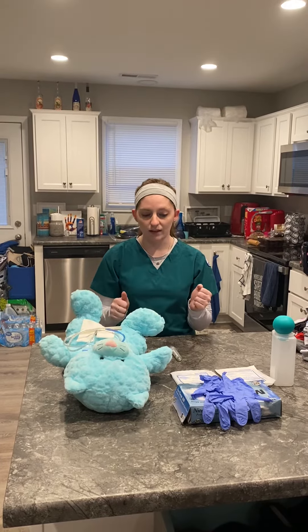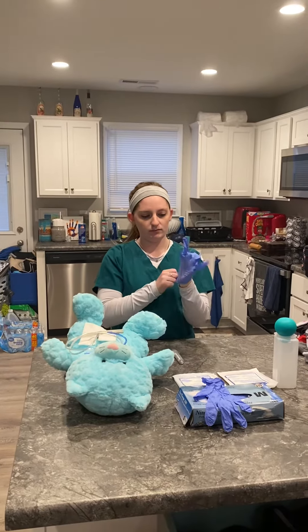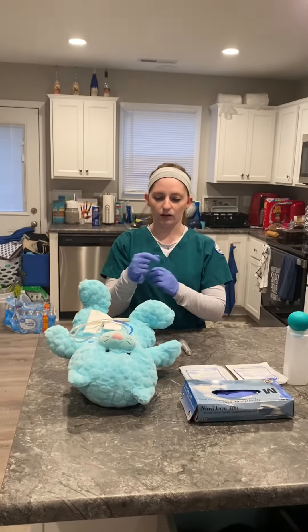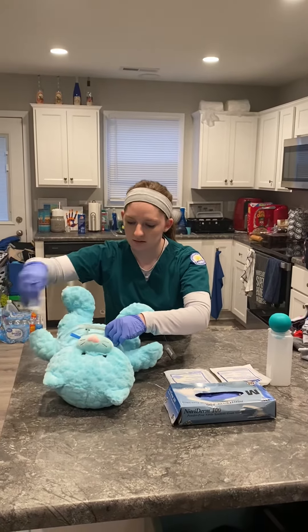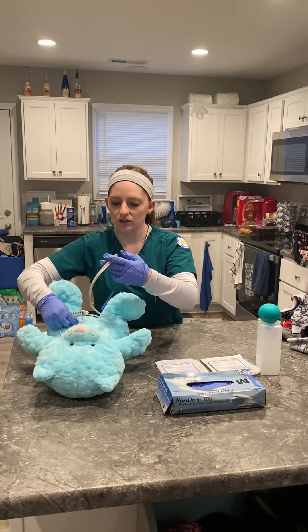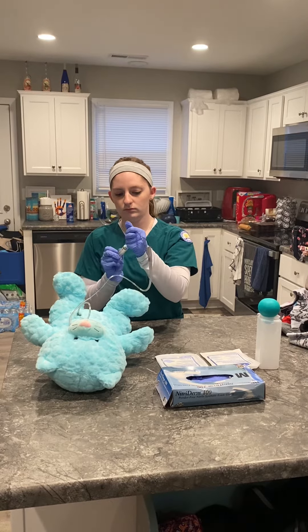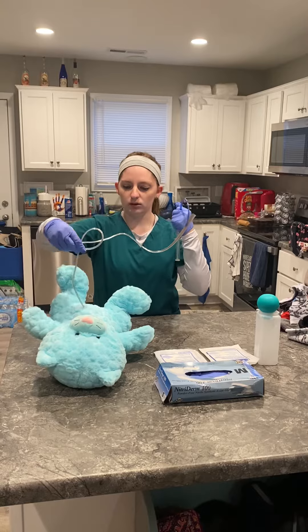I'm going to go ahead and don my gloves. I'll begin by removing the old dressing. I'm going to push it in one inch and deflate the balloon, then pull my old tube out.